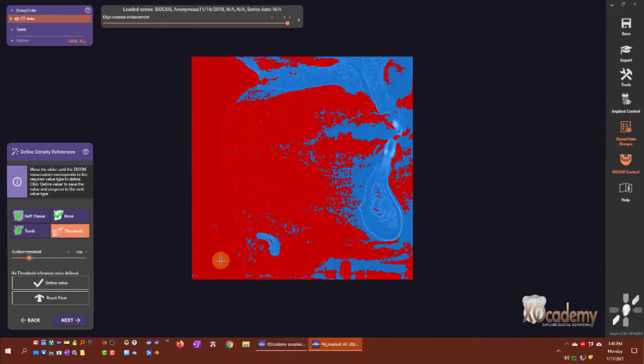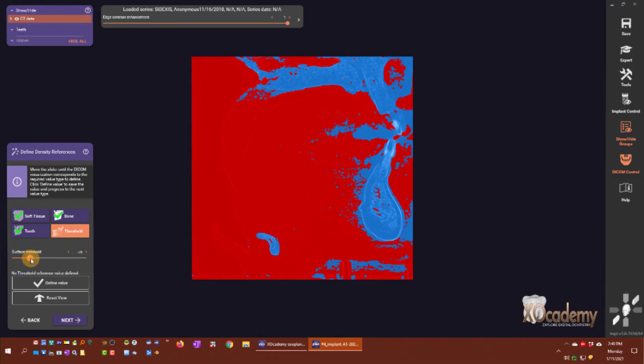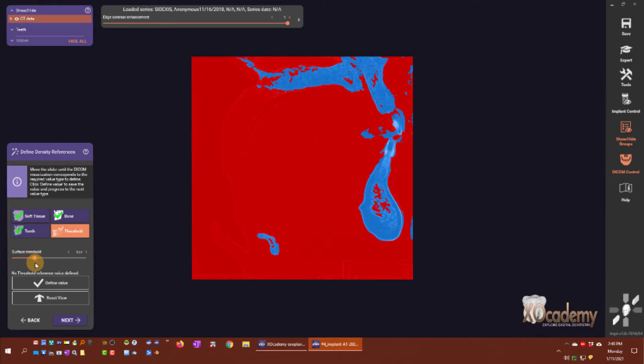When I have a bunch of blue scatter here in the patient's mouth, this is the sagittal view of the patient. You can see I have all the scatter, like where the tongue is, that is too low of a threshold. I want to remove that scatter maybe to about here.